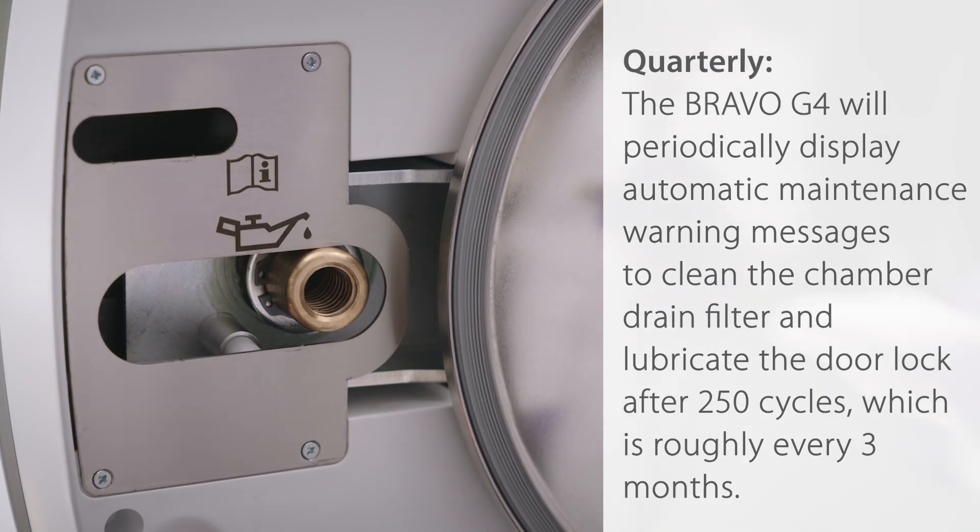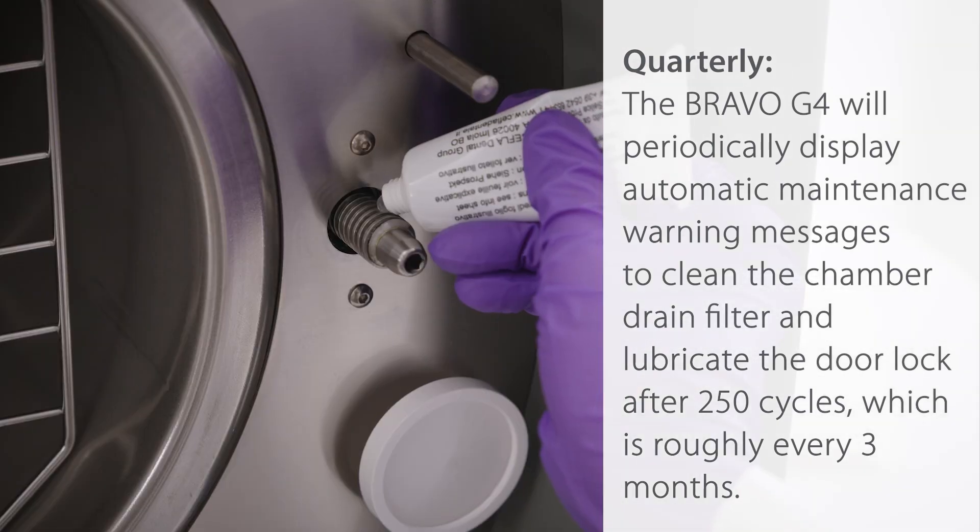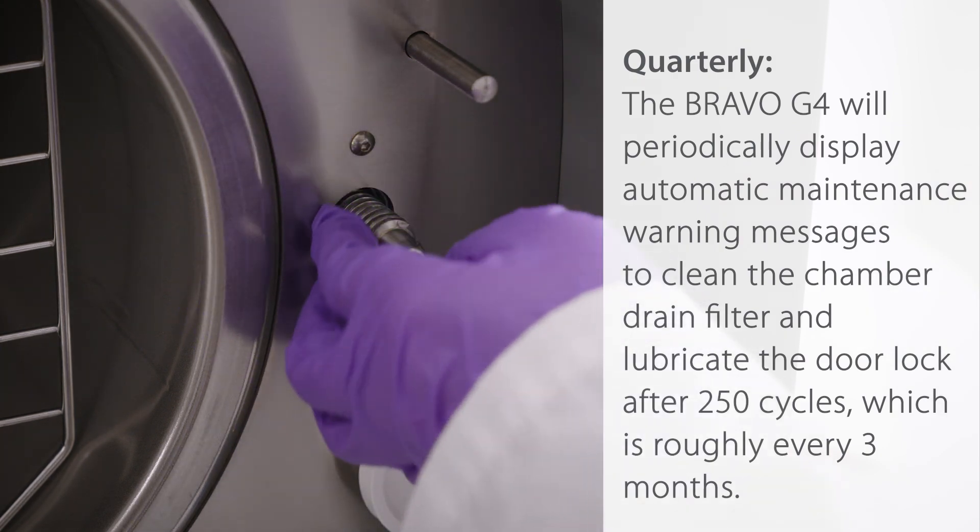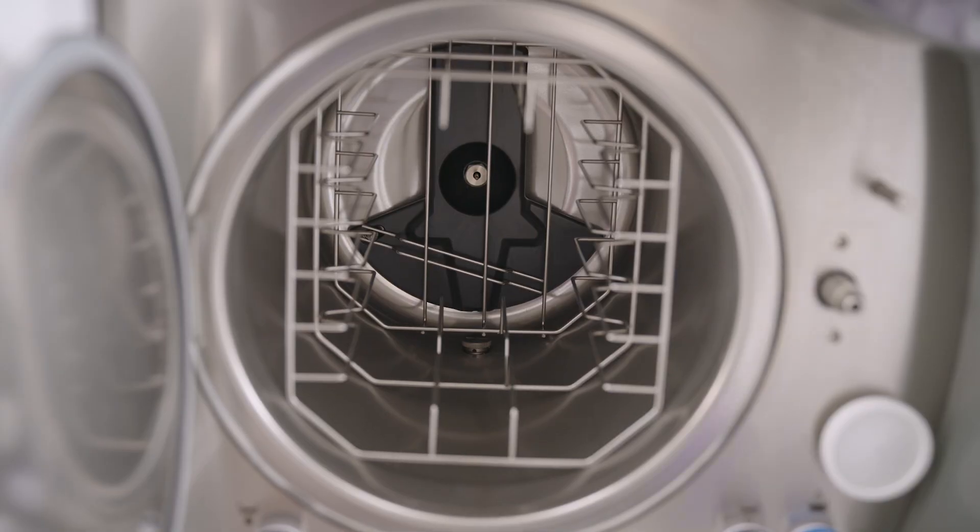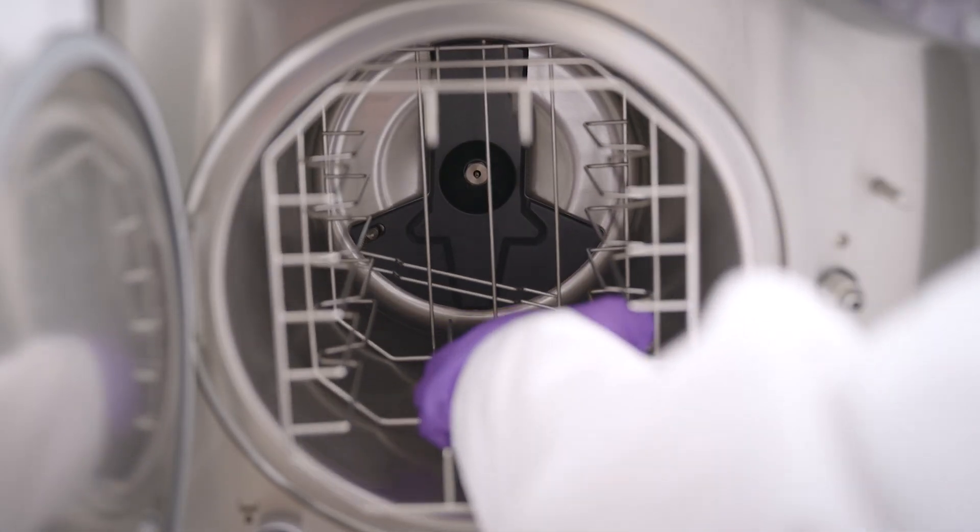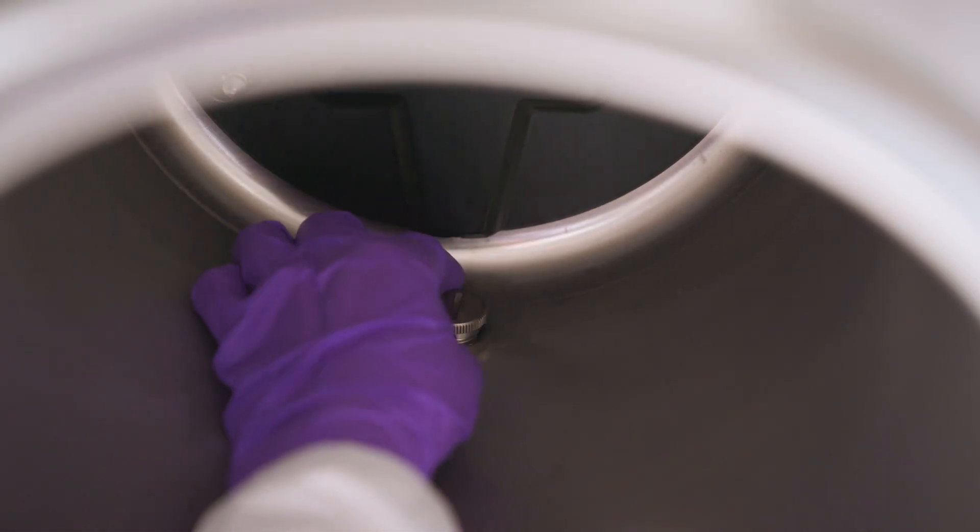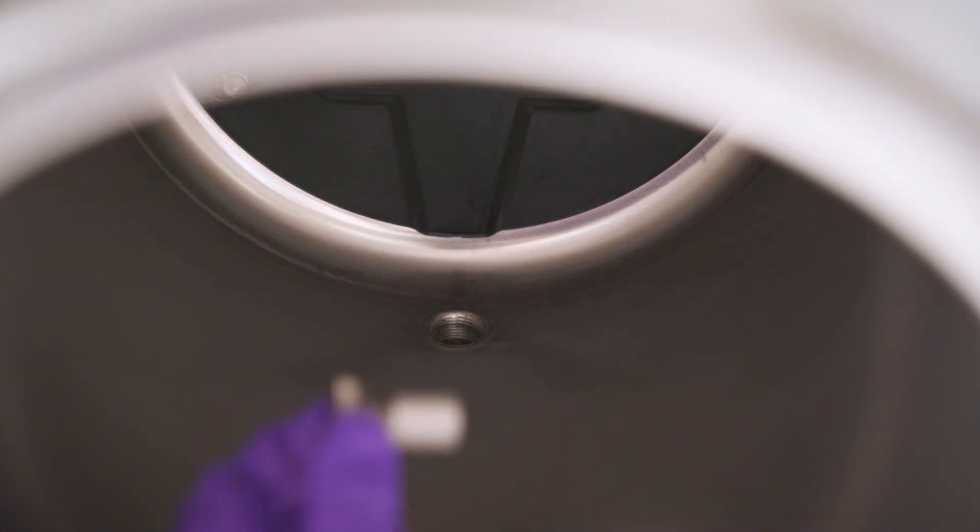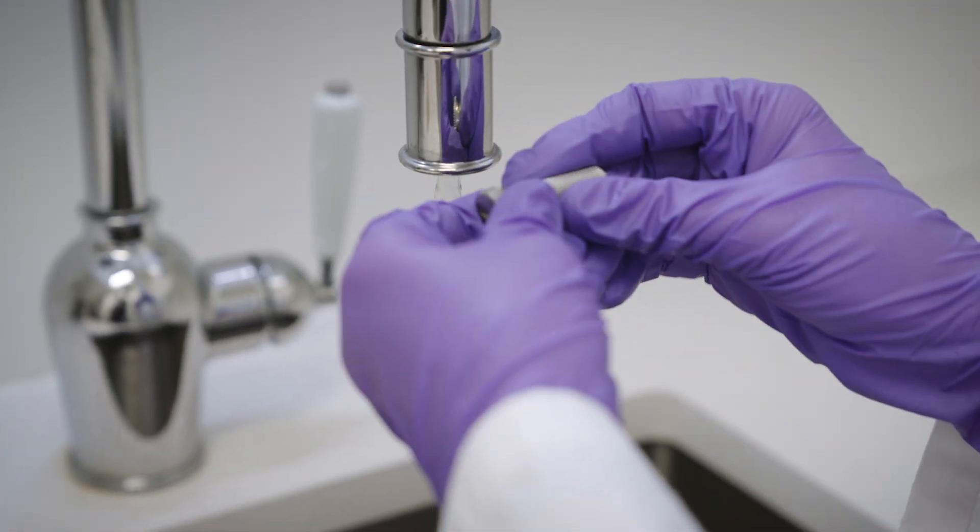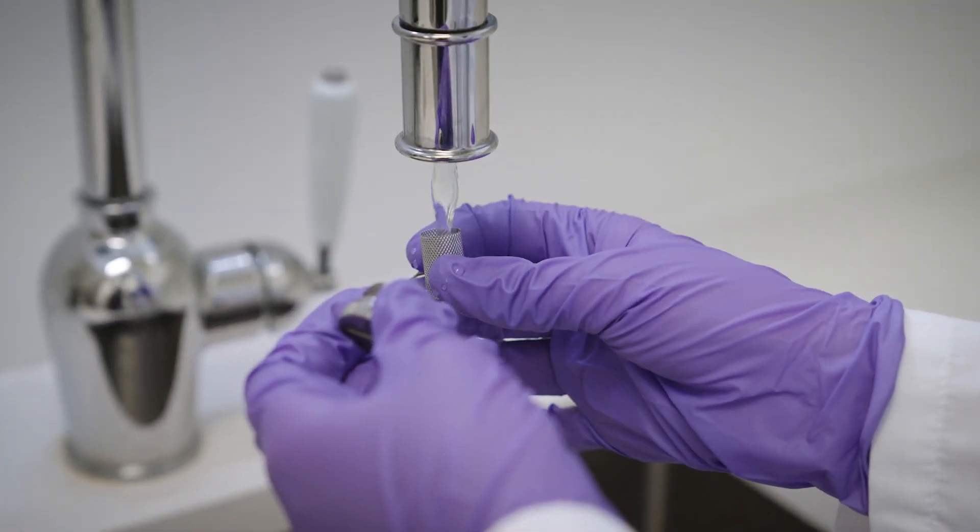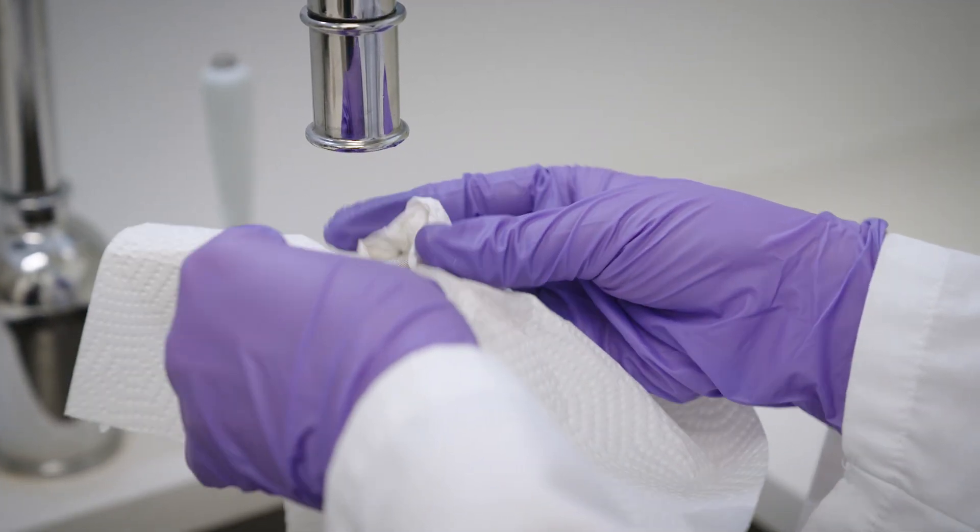Quarterly, the Bravo G4 will periodically display automatic maintenance warning messages to clean the chamber drain filter and lubricate the door lock after 250 cycles, which is roughly every three months. To clean the drain filter, open the sterilizer door and remove the cap using a coin or flat-bladed tool. Loosen the union that contains the filter. Remove the filter from its support and thoroughly clean it under a jet of running water and, if necessary, use a sharp tool to remove any large foreign bodies. If available, use a jet of compressed air to remove debris from the filter.